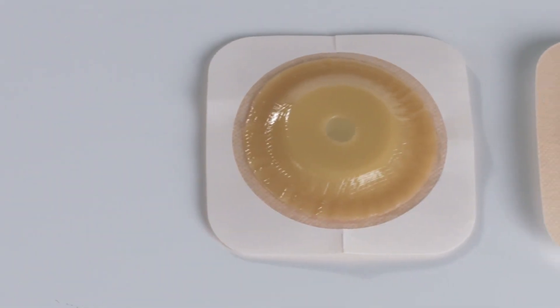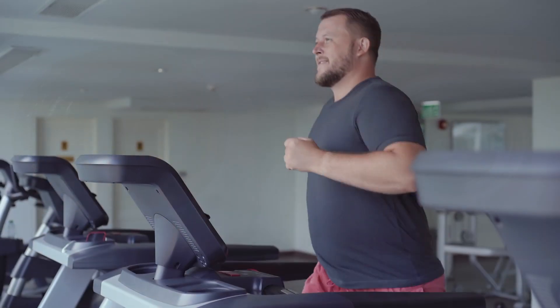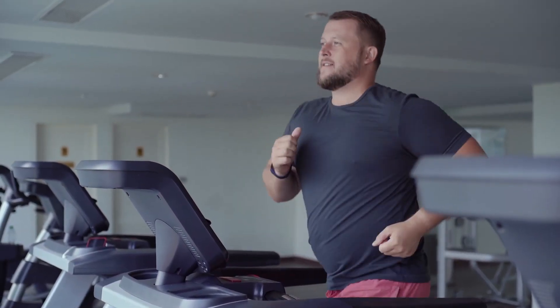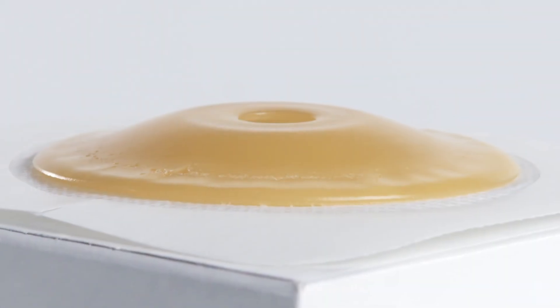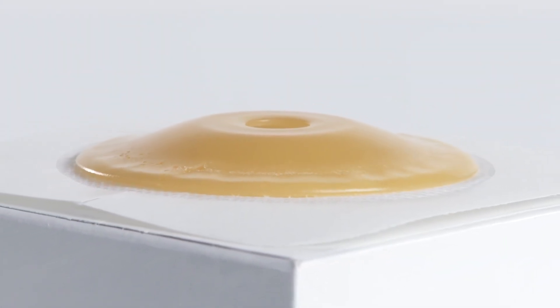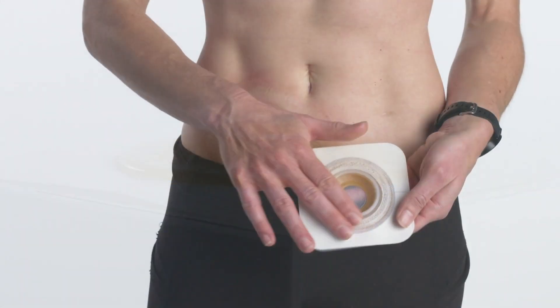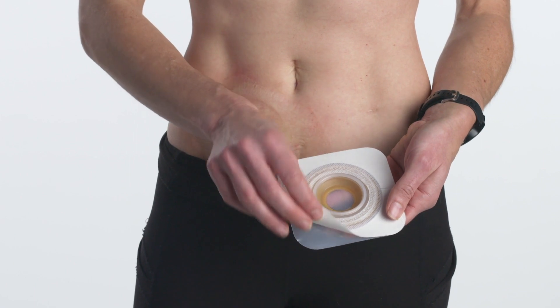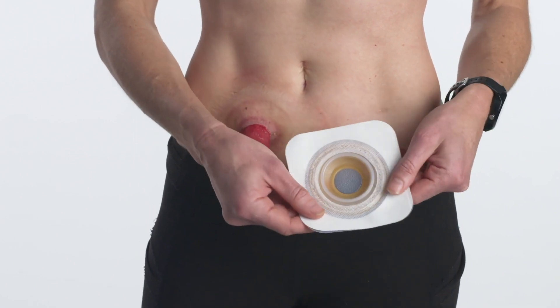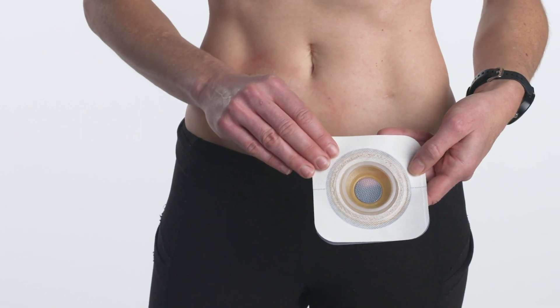Convex skin barriers are designed to help manage irregularities of stomas and abdomens to help reduce leakage and simplify stoma management. A convex barrier may be used if you have a flush or retracted stoma or skin folds near your stoma. We're using a pre-cut convex barrier, but convex barriers are also available in moldable and cut-to-fit options, as well as one-piece convex systems.